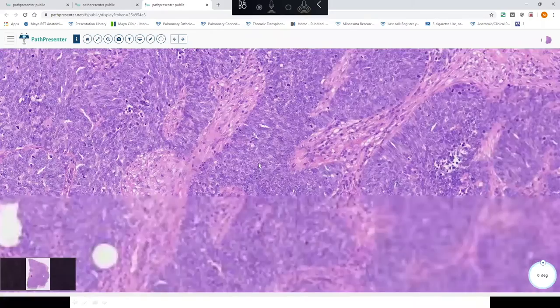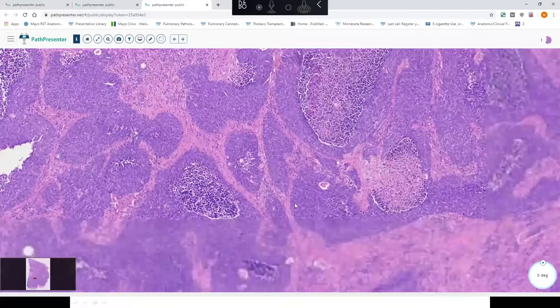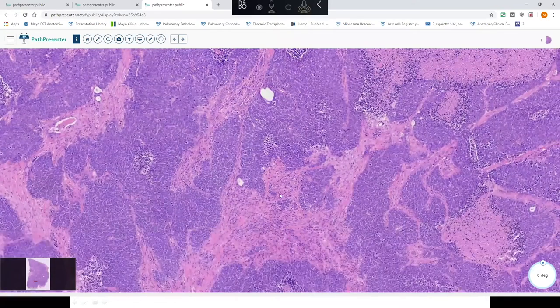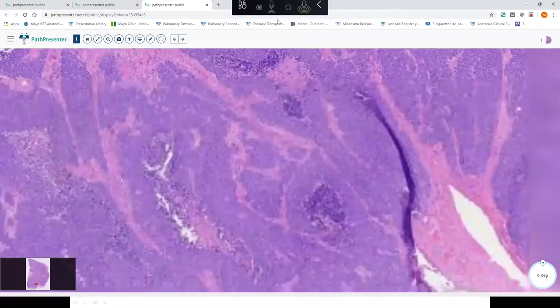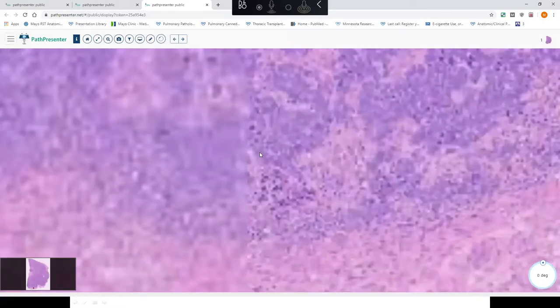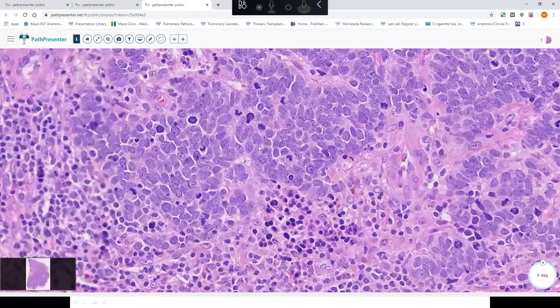And so it's dying off. Often the best place to look at the tumor from the morphology is if you go to the edge of it. It's usually the best preserved. So just going to move around to get to the edge of the tumor here. Move around a little bit. Sorry, just take a second to load here. So here we can see our tumor cells.